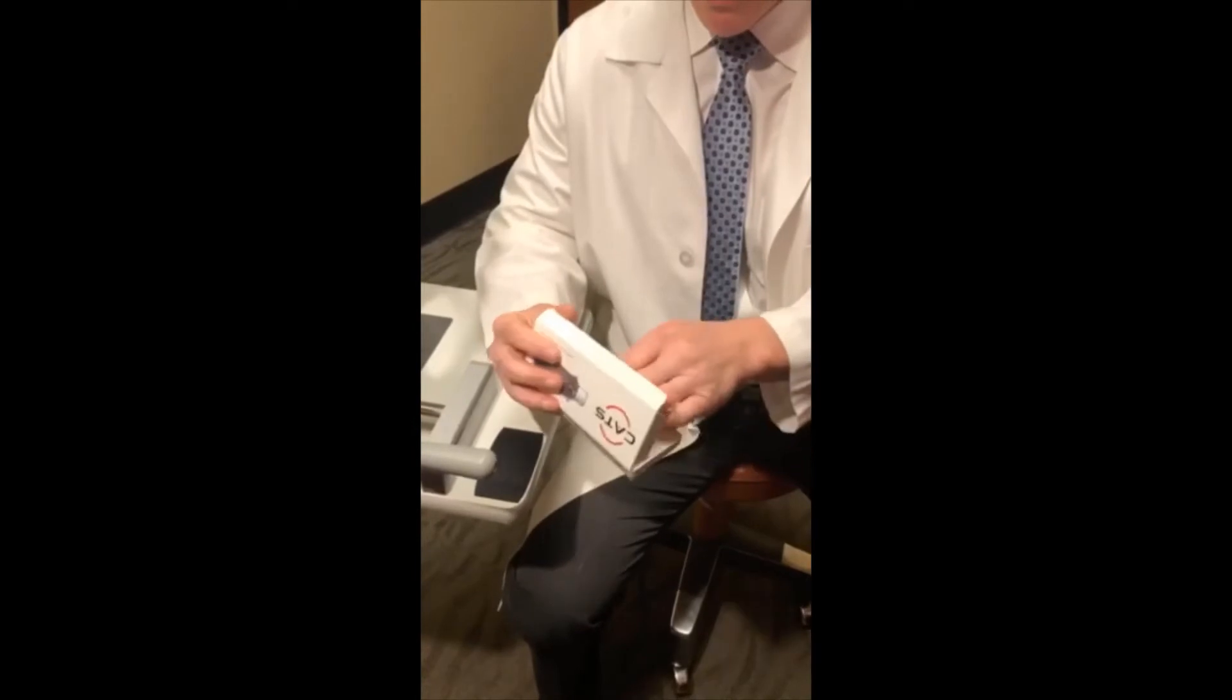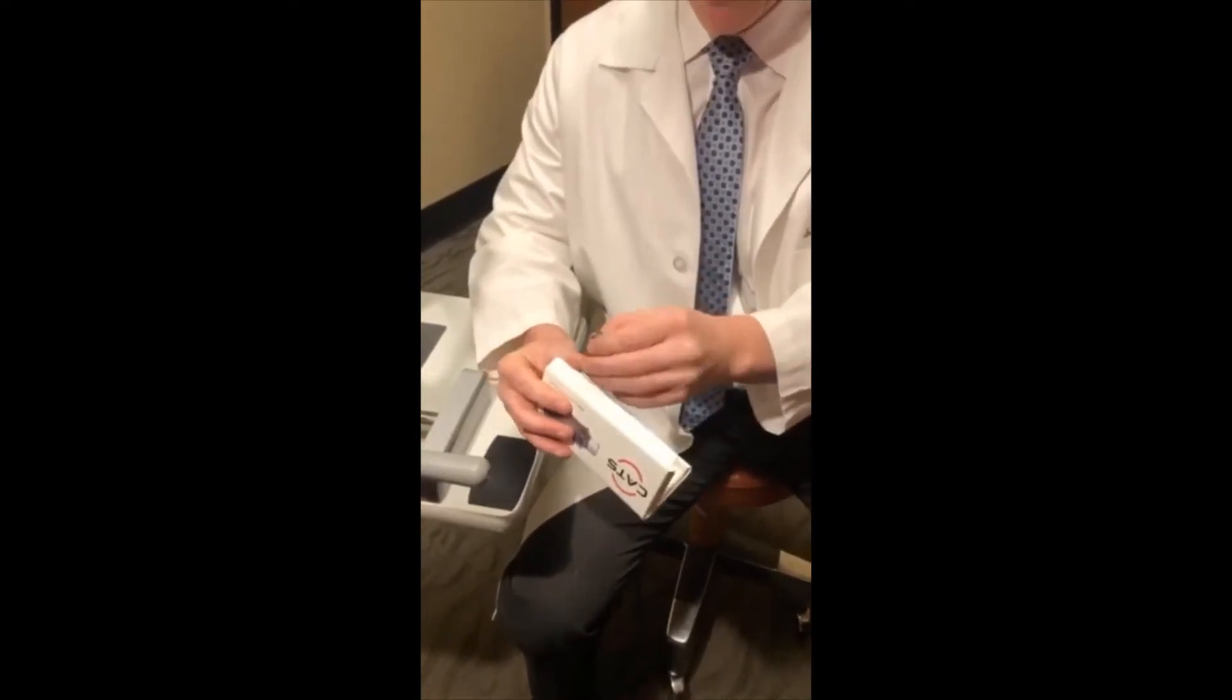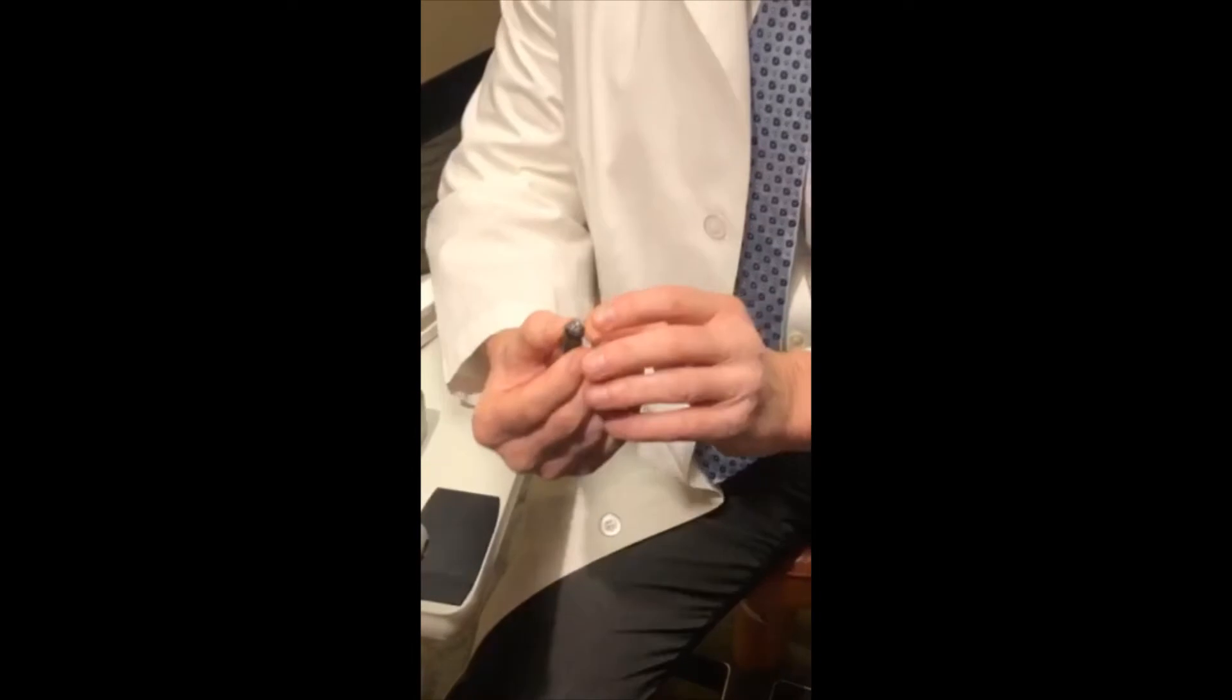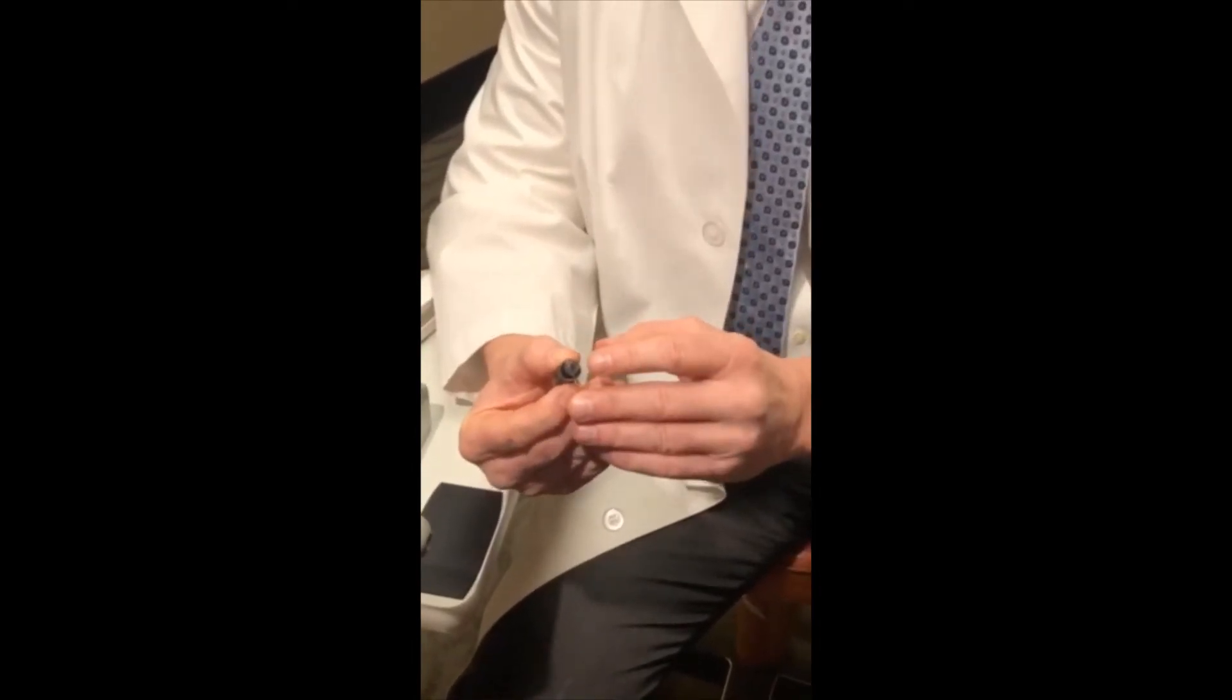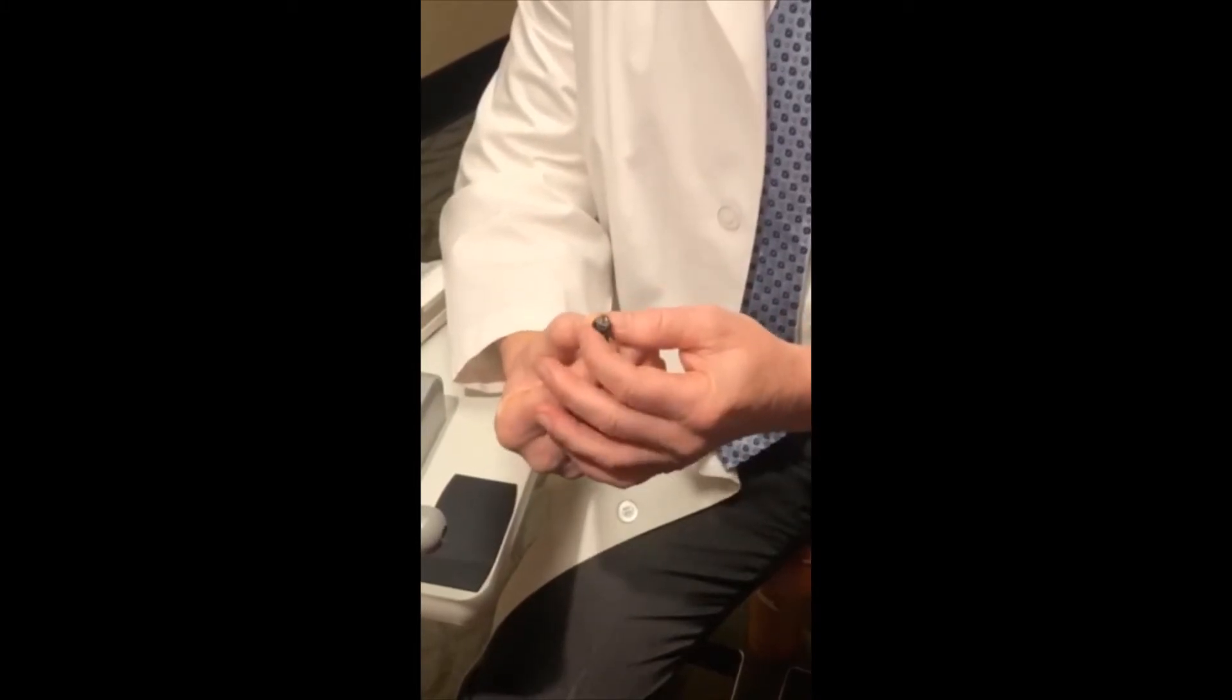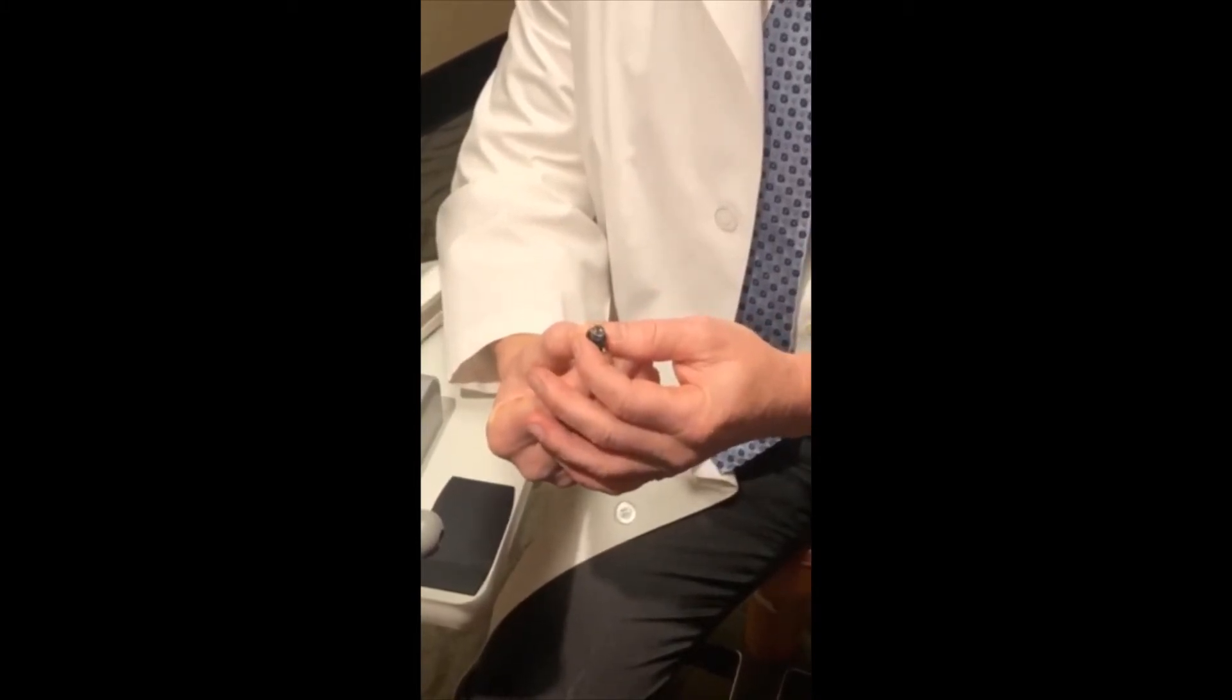When you open the box and examine the prism, you notice that it looks different. But mainly, you'll notice that the biggest difference is it no longer has a flat applanating surface. It has a slight dimple in the center. This is what allows the accuracy of the CATS tonometer prism in measuring pressure.